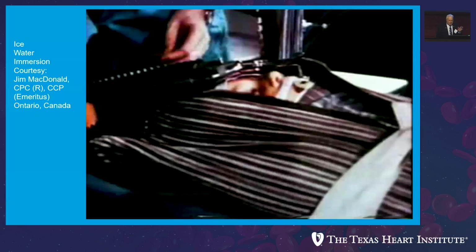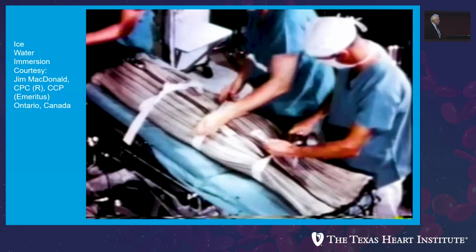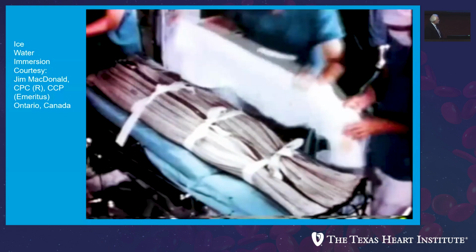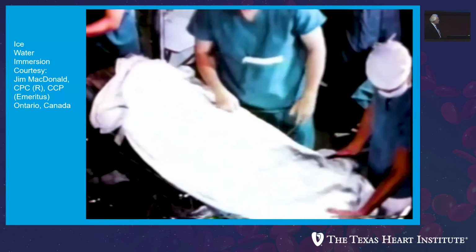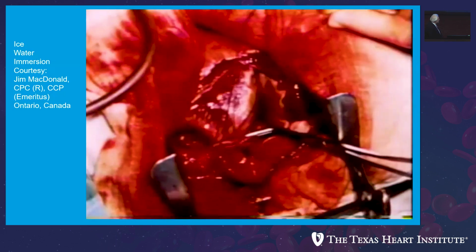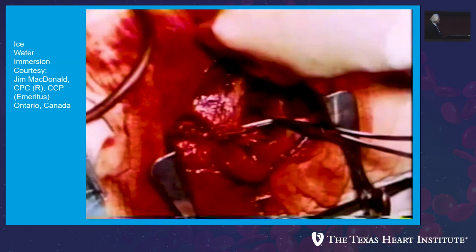Now, to begin with, I want to imply to you, there was a whole lot of innovation required, as you can see, in the beginning of our profession. This is the patient, a sickly 7-year-old girl, anesthetized and wrapped in a cooling blanket. Refrigerant circulates through the blanket until rectal temperature reaches 28 degrees centigrade. The cooling blanket is then removed. The patient is placed in a lateral position, and the heart and great vessels are exposed through a right thoracotomy. The right atrium is closed with a tangential clamp, while the atriotomy is sutured. The cava are released, restoring the patient's own circulation, and the heart takes over on its own.